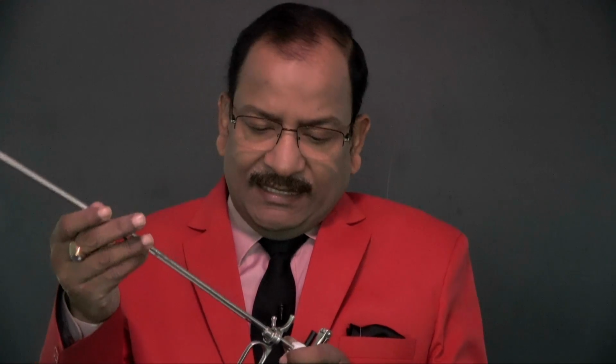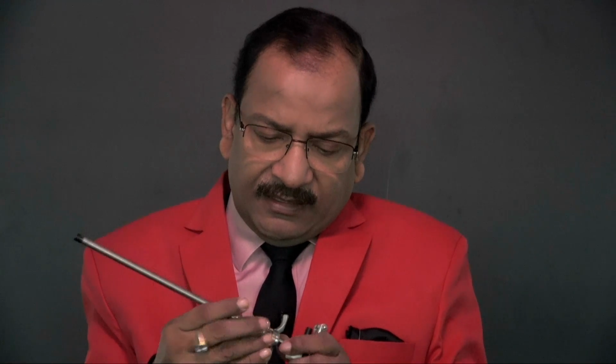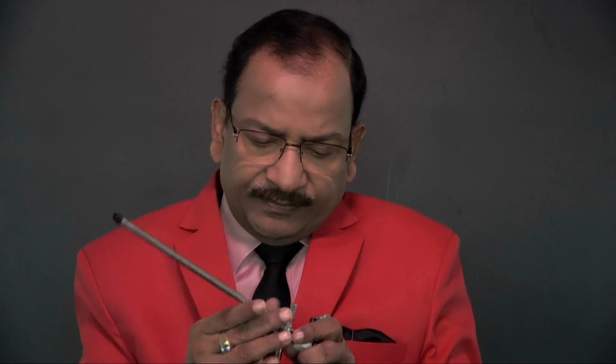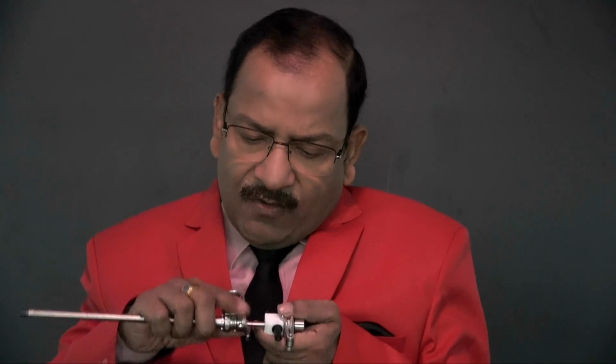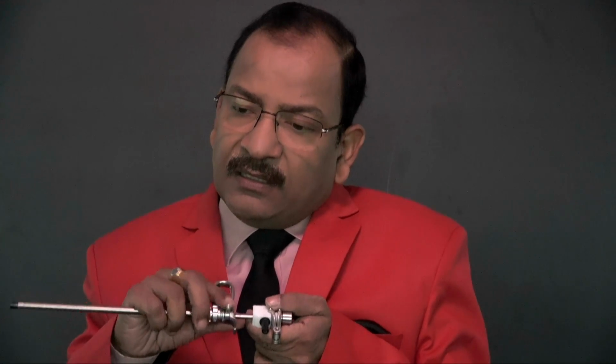After that, you will take the inner sheath. The inner sheath has two functions. One is that it has a ceramic tip that creates insulation, and the other is fluid input. So I am attaching this inner sheath and locking it. Here is the lock for the inner sheath, this lock. Anything you rotate clockwise is locked. Anything you rotate anticlockwise opens. It's a universal rule. And the good thing is it won't go the other way. If you try to go the other way, it will not fit.